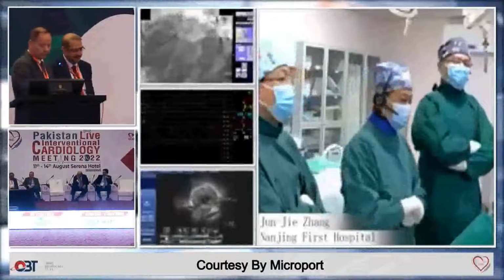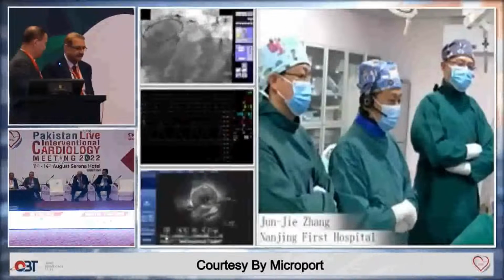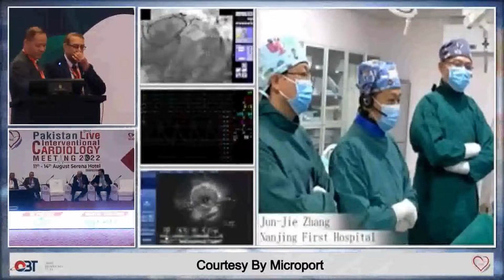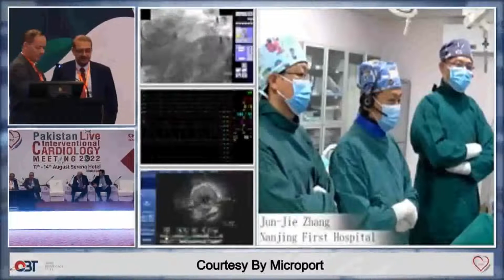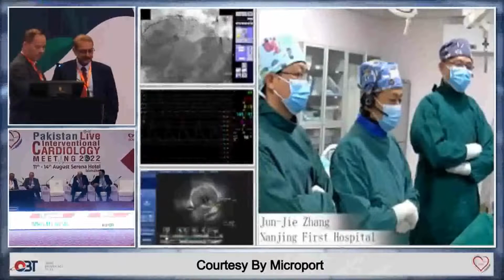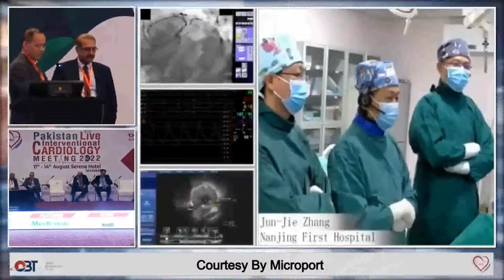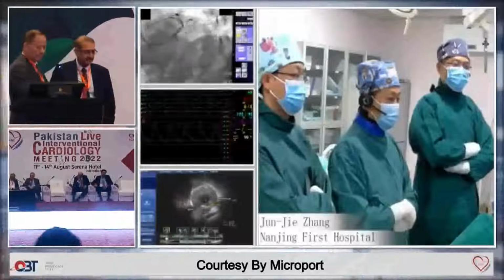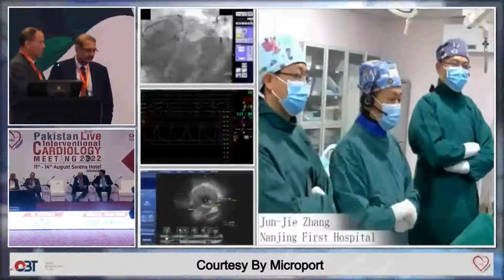So the interesting lesion, very classic of Nanjing, is still a left main bifurcation stenosis. So we already defined lesion complexity. Based on the algorithm we published, for a complex lesion you're going to do a two-stent technique. The issue is the origin of the marginal, whether you're going to leave it alone as part of your strategy, or do some modification of the plaque at the ostium before you do a two-stent strategy.